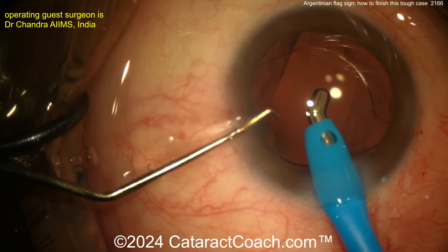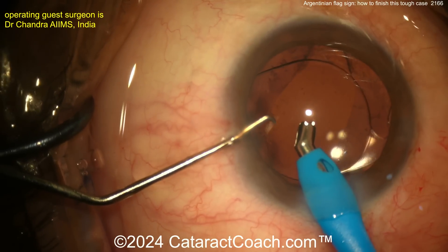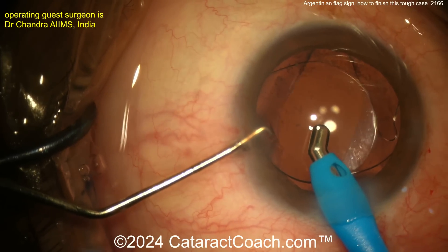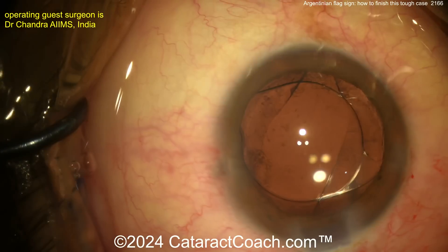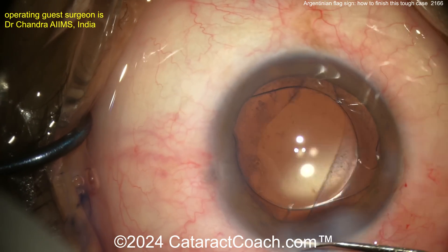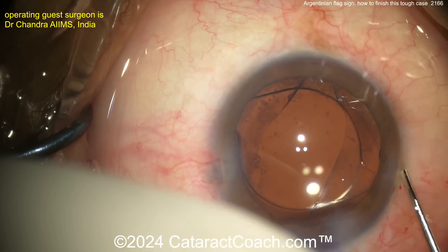I don't want the AC to deflate too much. You're going to run into this one day. Even if you're an expert surgeon, there are certain cases where you just can't help it — you're going to get this anterior capsule split open, the Argentinian flag sign, and you need to be able to know how to manage it. Our guest surgeon — got to give credit — good job.